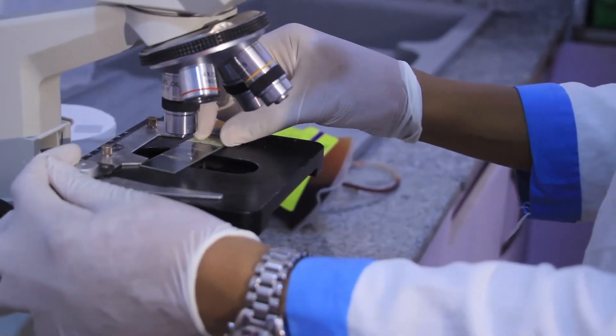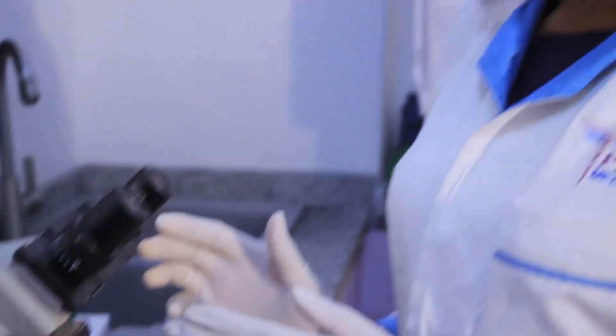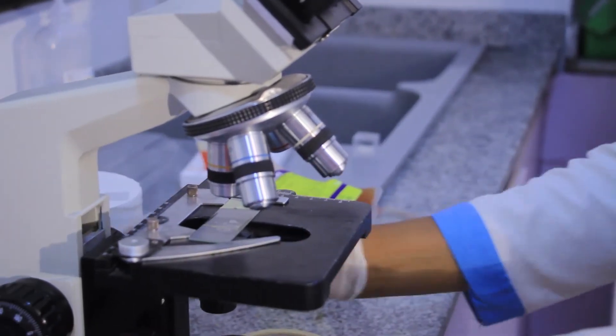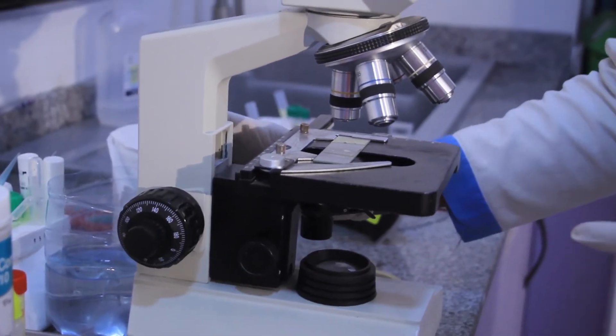This is actually the easiest part. When we're viewing, we're going to use times 10 and times 40 objectives. Ensure that we've completely closed the iris condenser and focus with our times 10. We use the coarse and fine focus to view. We check if there is presence of agglutination. If there is agglutination, then that blood is not compatible. But if there is no agglutination, then feel free to give out the blood. Don't forget to follow the standard operating procedure for cross-matching blood. I hope you've liked something from our video.